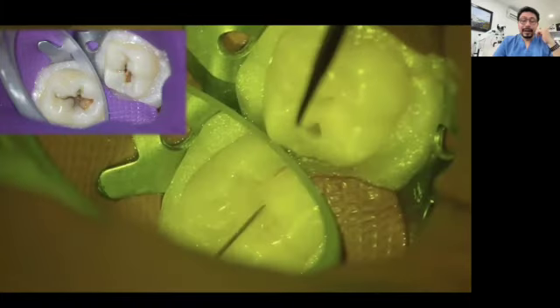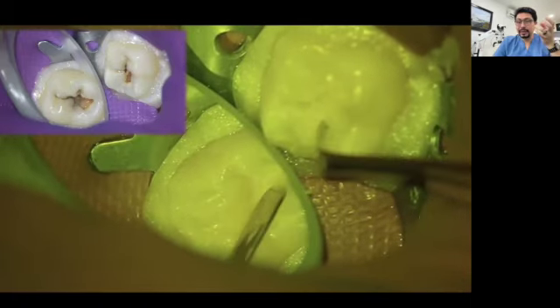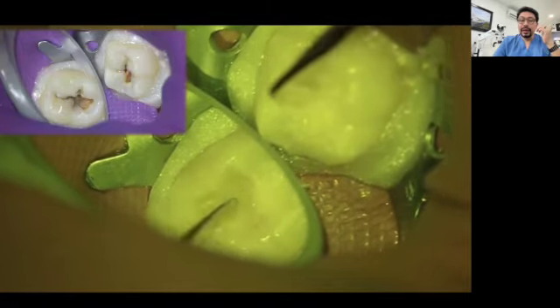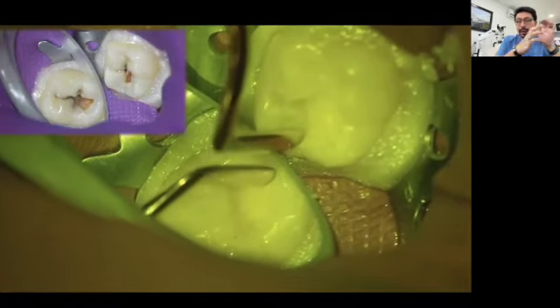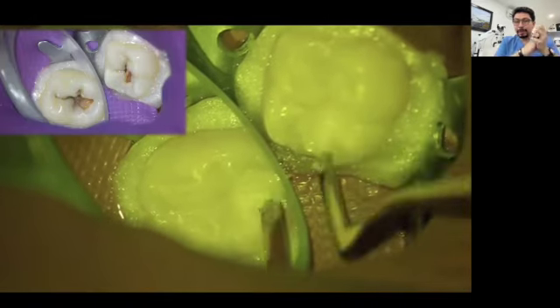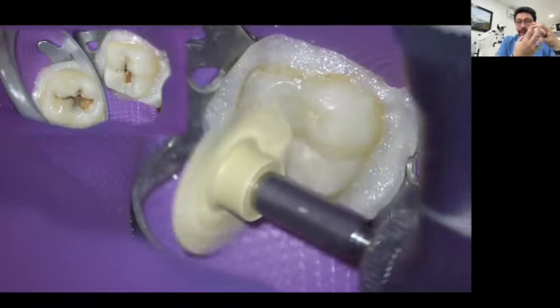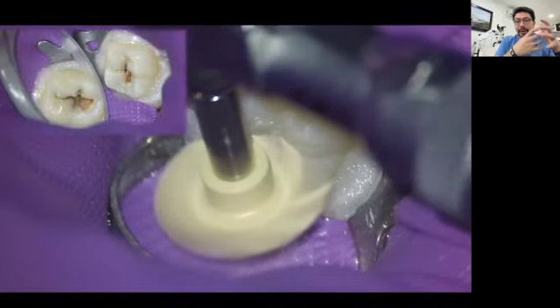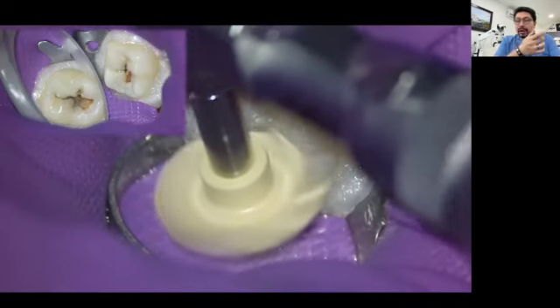One filter is the orange filter that helps you for working with light sensitive materials like the composites or the resins. You can work with the orange filter, and then you will just need to photo cure the material for getting it hard. If you do not use the orange filter, the material will react to the light of the microscope because the light is very strong, it's very powerful, and it will react with the materials, and the materials will get hard. And the microscopes also come with a green filter.